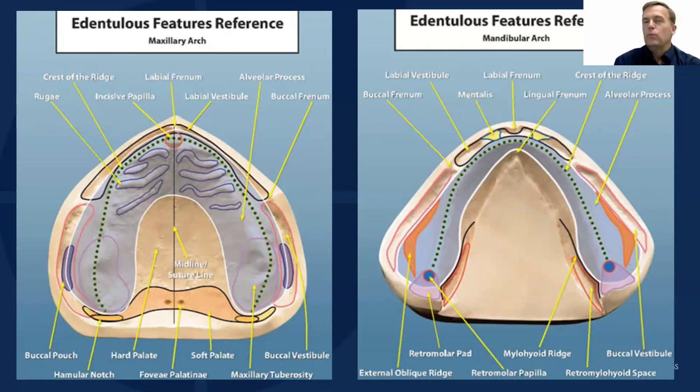And the other thing is when you're looking at your casts or your impressions, you can say, hey, did I pick up all these landmarks? And if you didn't, you may want to take another impression just to make sure that you're providing your lab with enough information. So a couple questions.